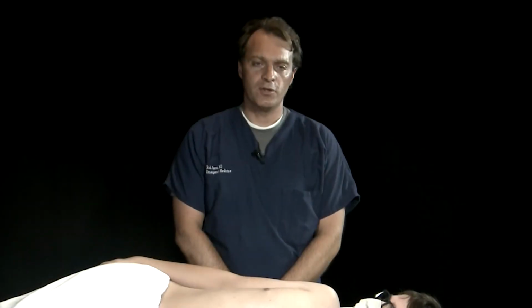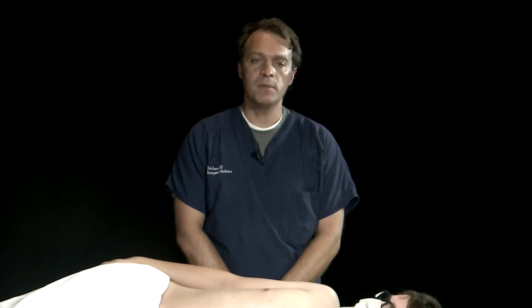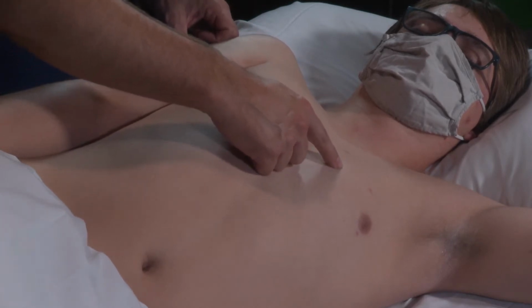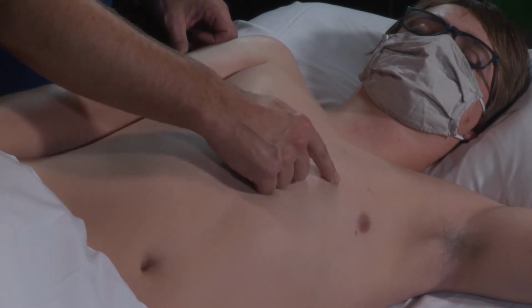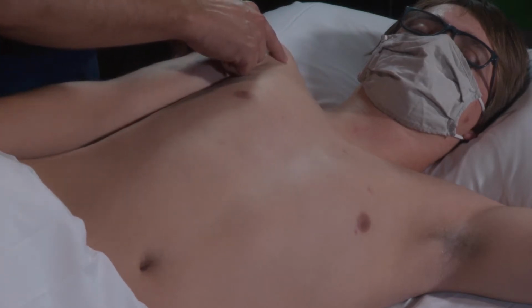For the non-traditional 4-view cardiac exam, we're going to start off by imaging in our parasternal windows. Our parasternal windows will be found by placing the probe immediately lateral to the sternum, somewhere between the second and fifth intercostal space here. We're going to start off in a parasternal long axis view with the marker dot pointed towards the patient's right shoulder.